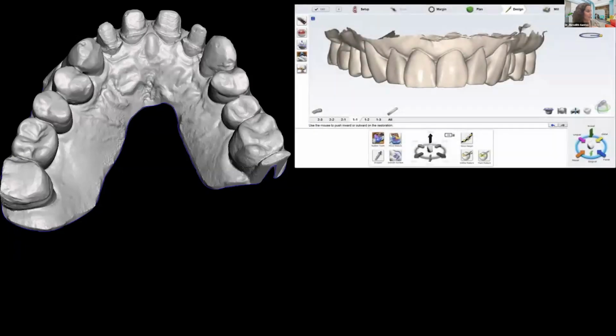I love the concept of using a couple, like one Emax on either side, to hold that vertical, so you can control the bite and the wear pattern more, especially if you have them in a guard. That's so thoughtful. I've never thought to mix the materials like that. I love that suggestion. That's really cool. Thanks. And from an economic standpoint, the cost of an Emax block is really the same as the cost of these hybrid blocks, so you're not really losing out too much when you use those materials. It does take a little longer because it requires an oven cycle, but it's not a bad thing for you to mix in those more wear resistant ceramics.